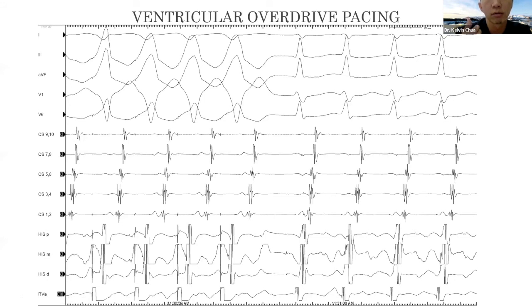Ventricular overdrive pacing. Once we have demonstrated entrainment, then we should look at the response. We also typically call this a VAV response, or more accurately a VAHV response. There's a His, which is very nicely pointed out. And number three, there are many different ways to look at it. Sometimes you look at the PPI. This PPI looks a bit long to me, I'm not sure. Yeah, but there is also AH prolongation, so it's difficult to tell. We need to really correct that to be sure. And number four, I think the VA time during entrainment, which is the V pacing, and during tachycardia is a bit different. So I'm not sure whether there is an accessory pathway. I'm just not convinced that it is participatory. I might do even more maneuvers, but this is just me.